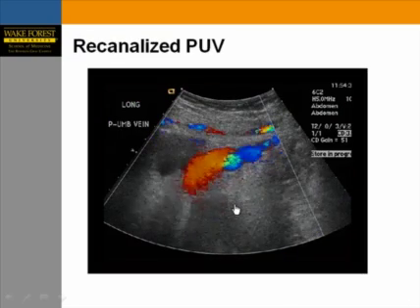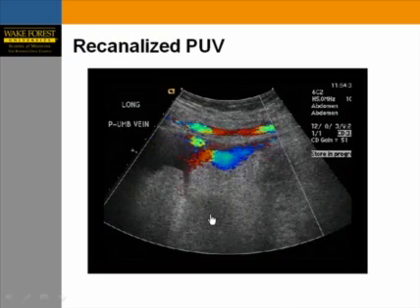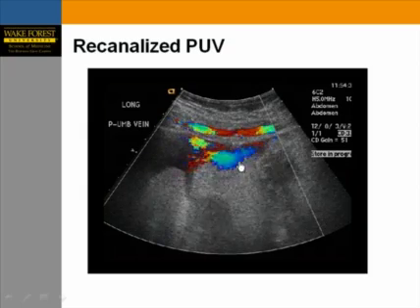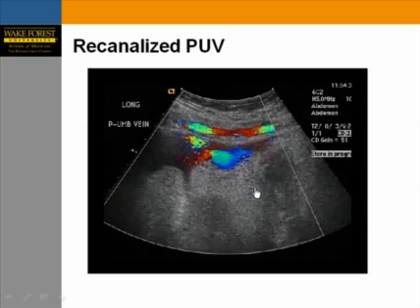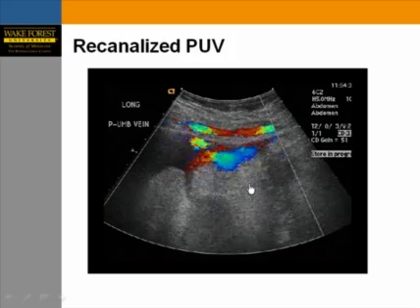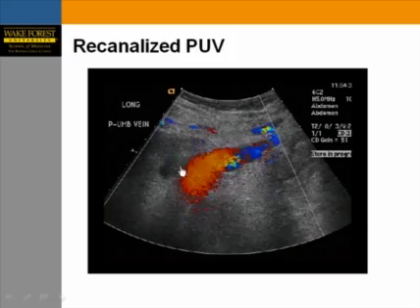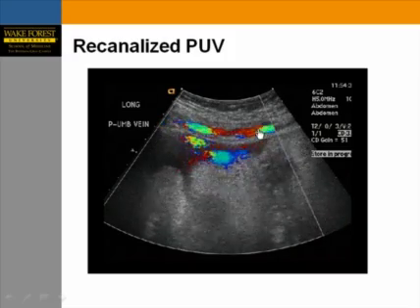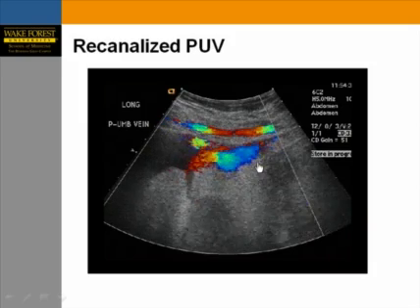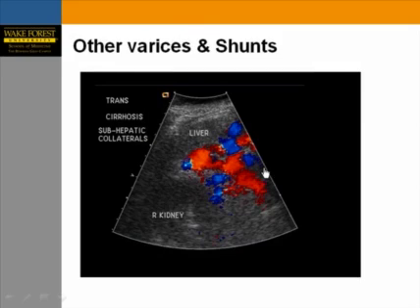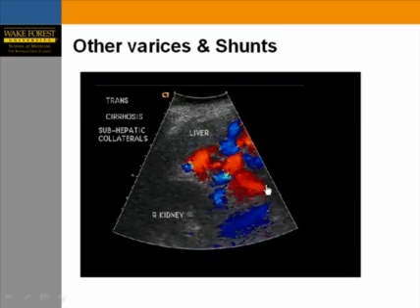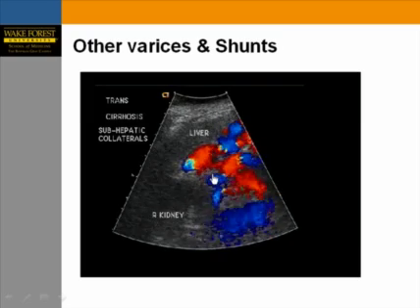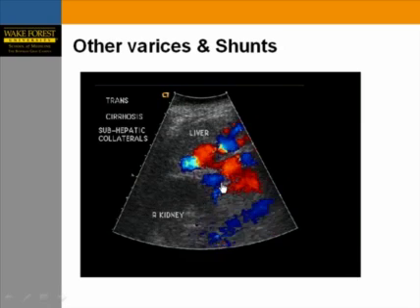This is an example of an enlarged periumbilical vein extending to the surface of the abdomen and up toward the chest. Without color Doppler, you may have trouble identifying that component in the abdominal wall. Another example shows massive sub-hepatic venous collaterals in a patient with portal hypertension and cirrhosis.